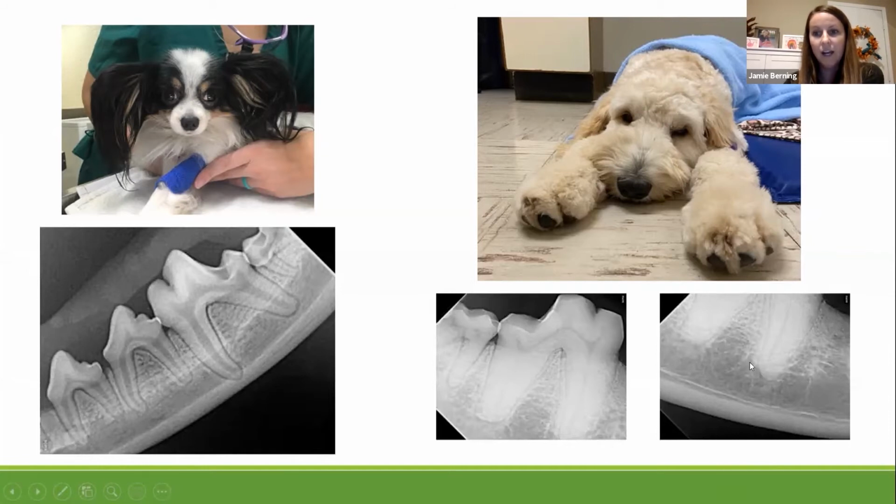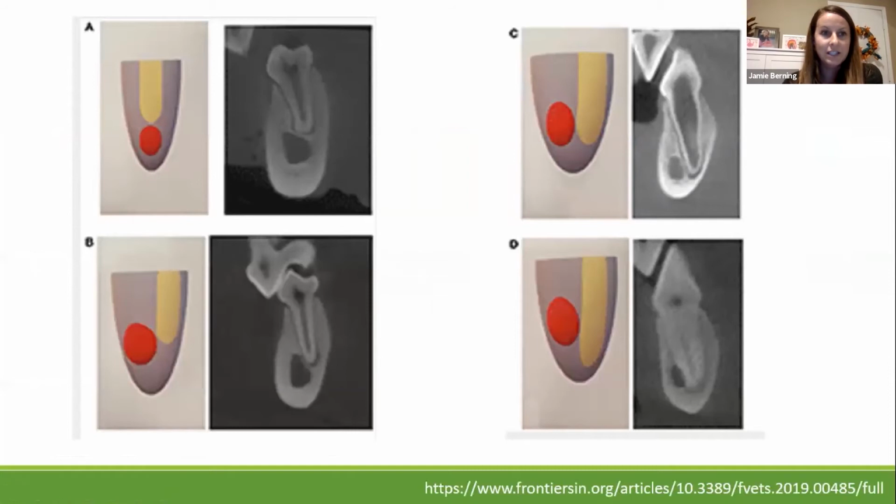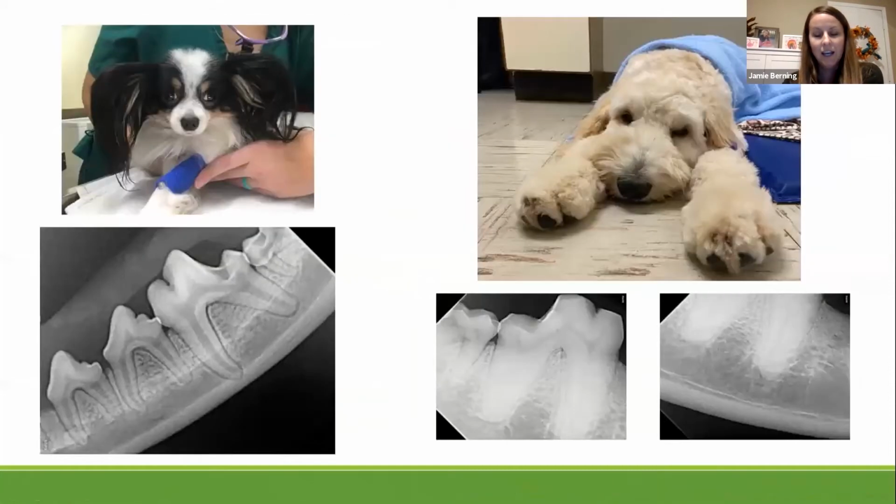We have a little bit, but certainly not more than 50% overlap with that mandibular canal. Here we have 50% or more, but not going past that mandibular canal. And then here we have it actually extending beyond the mandibular canal. So we can see when we look back at these, we can actually see 1, 2, 3, and 4 positions when we look at it like this.